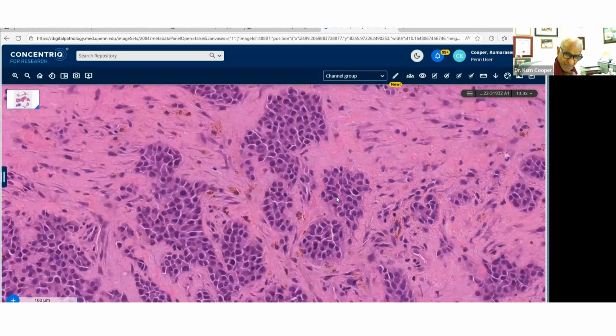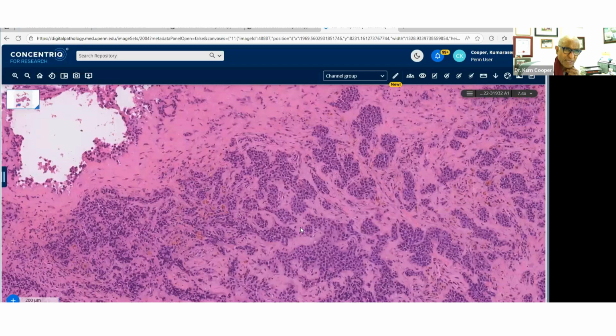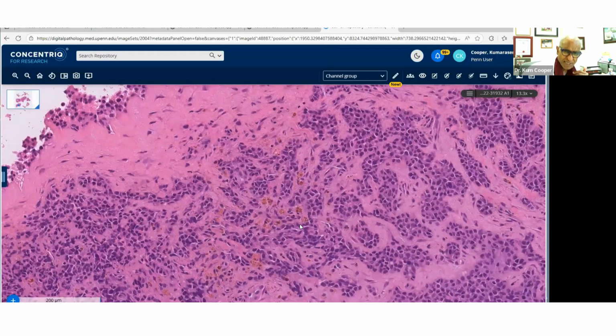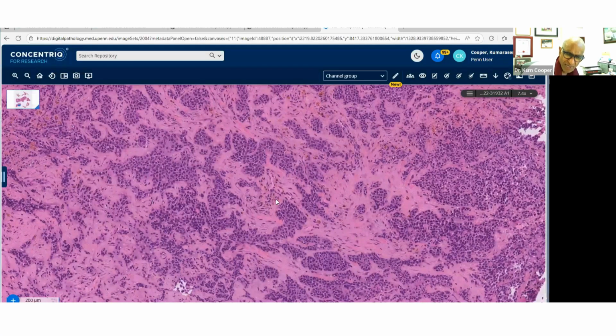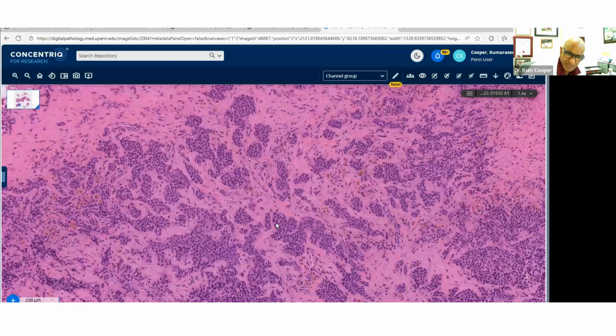Yeah, they can be cellular. And if you think about it, I always say to my trainees, fellows, and residents, if you think about something, just do the stain. Particularly in odd sites with so much cautery artifact, there's no harm in doing that. So, although it doesn't strike me as being a solitary fibrous tumor, the lack of the vascularity, the lack of the patternless pattern, the hyalinized vessels, the alternating hypercellular areas, etc., etc. But if you thought about it and if you did it and we were working together, I wouldn't be too upset. Myoepithelioma, we just talked about that.